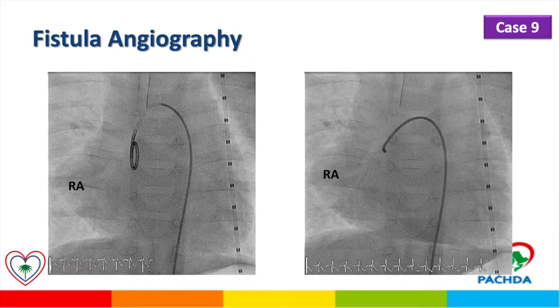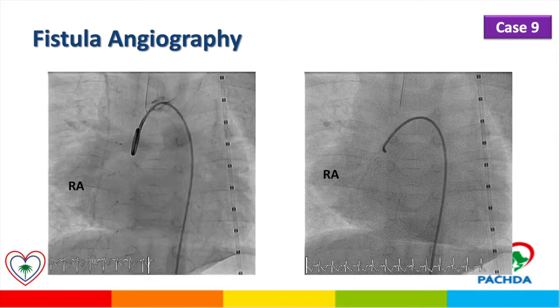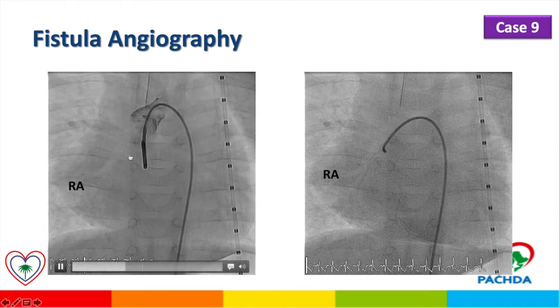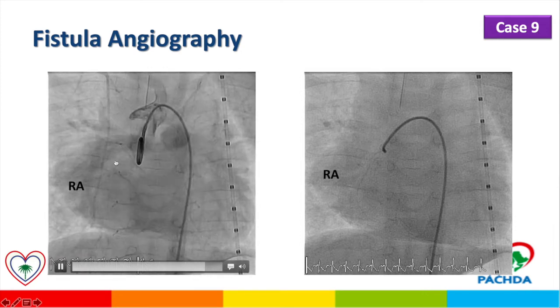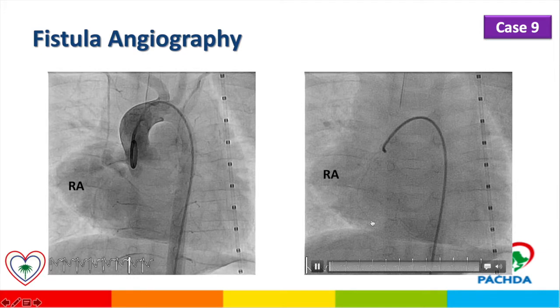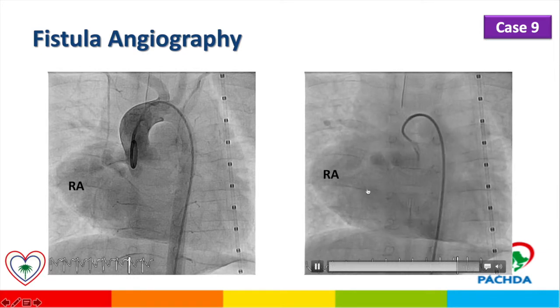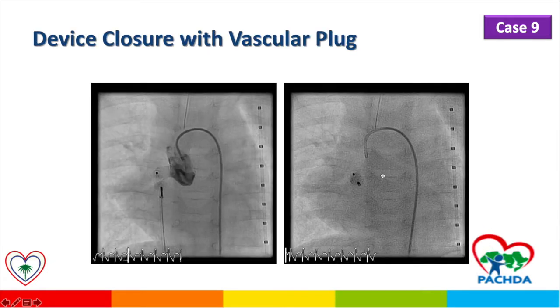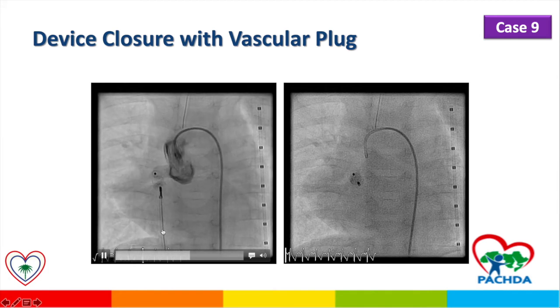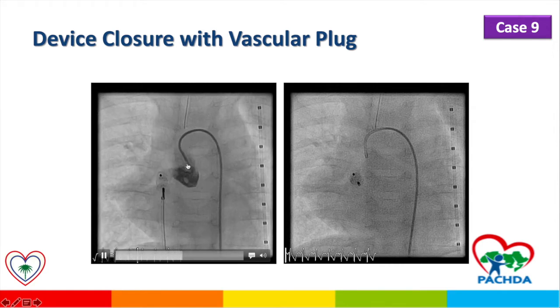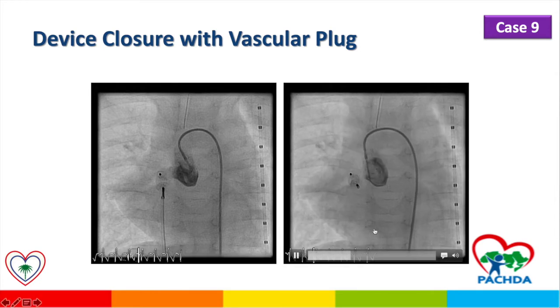This patient was taken for angiogram and interventional treatment of the fistula. The first injection in the ascending aorta shows a dilated right coronary artery with opacification of the right atrium, confirming a fistula between the right coronary artery and the right atrium. Selective angiogram shows the right coronary artery in normal caliber distally, with a huge fistula proximally. The fistula was entered from the right atrium and a vascular plug was inserted. A testing angiogram confirmed closure, with normal flow into the right coronary artery.